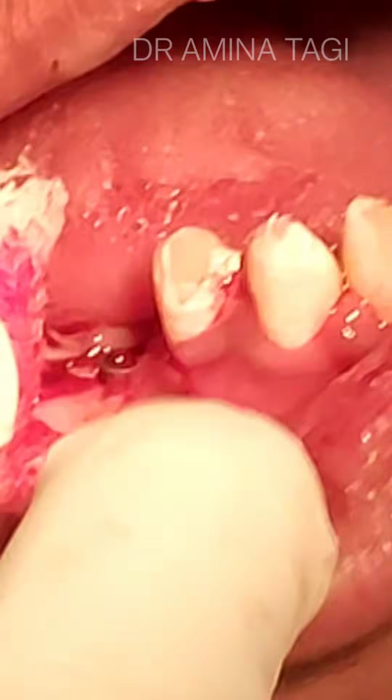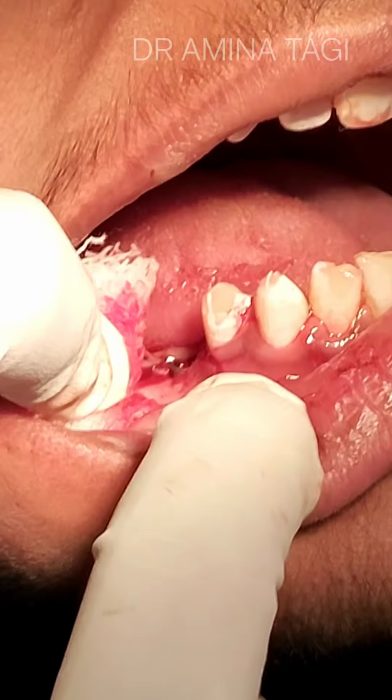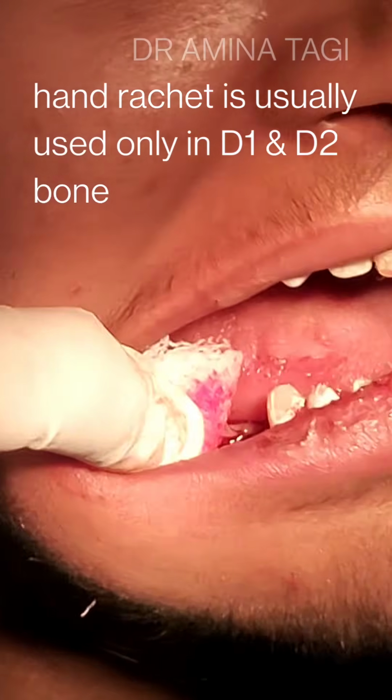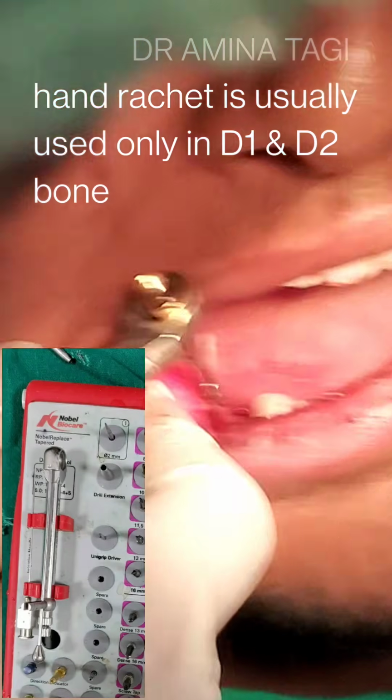So I'll be using a hand ratchet to get a better grasp of tactile sensation and to try to insert the implant at the crest level. So this is the ratchet that I'm using.